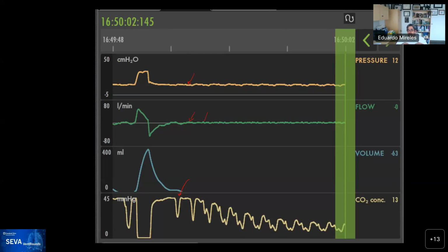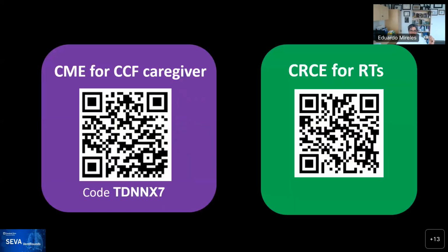Victor asked why the patient is on auto mode. Well, at that time, the patient was on auto mode because she was coming out of paralysis, Victor. You can have anybody on auto mode and ask why. It's because they are on PC-CMV, and when we stop the sedation or the paralysis, they can switch to volume support. You can make an argument there, but that was the argument at that time.